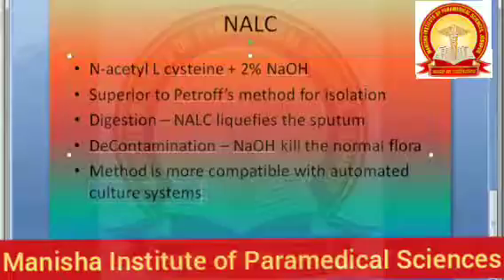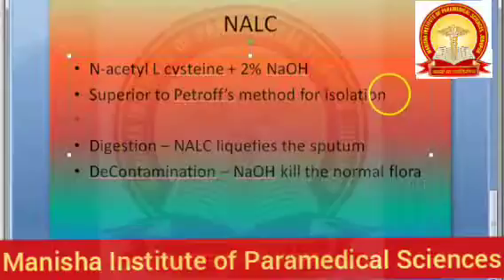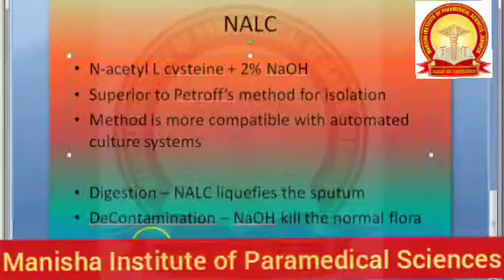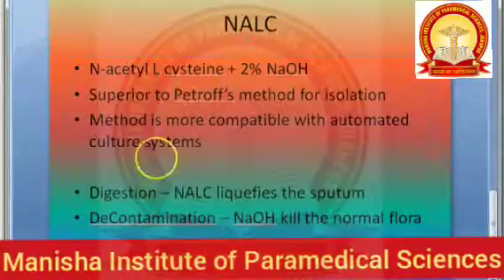Very good. So it is superior to Petrov's method. It is more compatible with automated culture systems. Then what else should we see? This much. So two methods they have told.